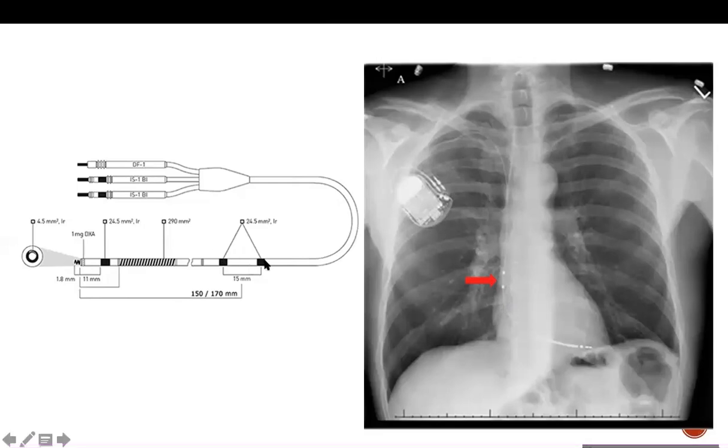So what do you think those electrodes are going to do? They pick up signal. For pacing, you don't have enough contact with the myocardium to deliver a sufficient amount of energy. They're on the lead, but not attached. They're in the atrium, but they might be able to sense the atrial signal. It's high in the atrium, so you're trying to be closer to the sinus node to sense an atrial signal. So with this kind of lead, you can sense the atria, and you can pace and sense the ventricle because the tip of the lead is attached to the ventricle. You might utilize that in a dual chamber device. That's why you see more than one.